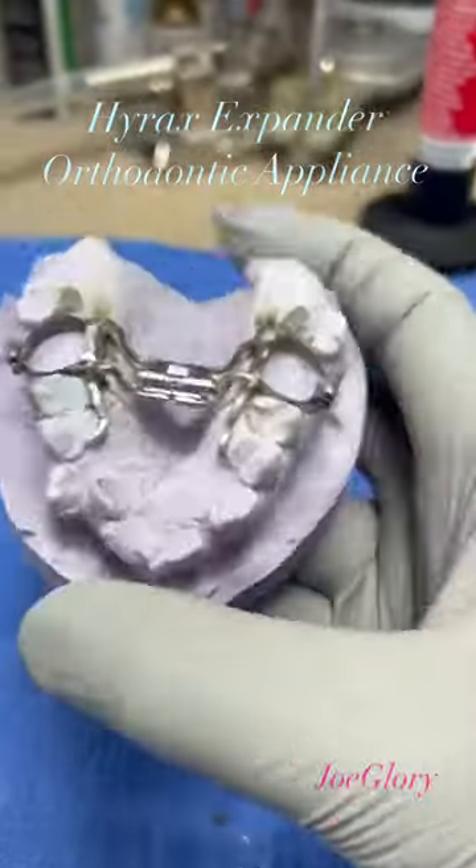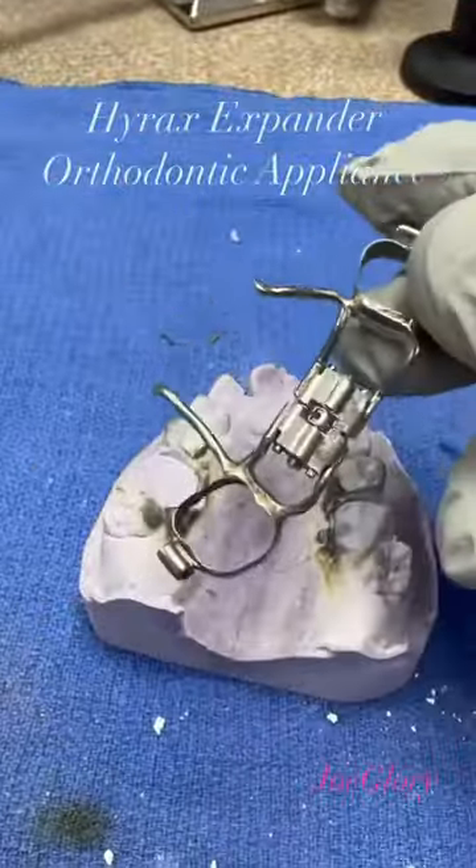Here you go guys, that's the Hyrax — a Hyrax expander is an orthodontic appliance.